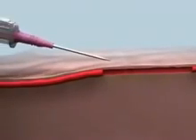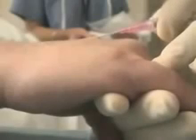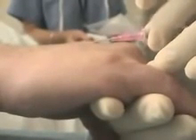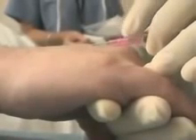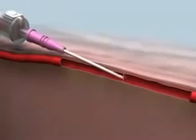Blood might flash back into the chamber if the tip of the needle has entered the lumen, but the cannula has not yet entered the vessel lumen itself. This problem can be avoided by reducing the angle of the catheter and advancing the needle a few more millimeters into the vein. A valve within the vein may prevent advancement of an inserted catheter.